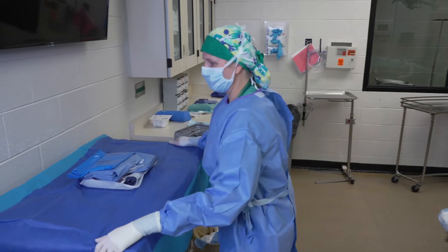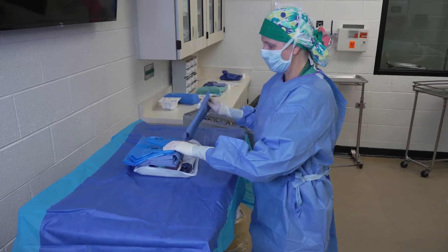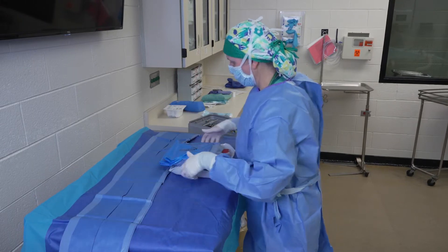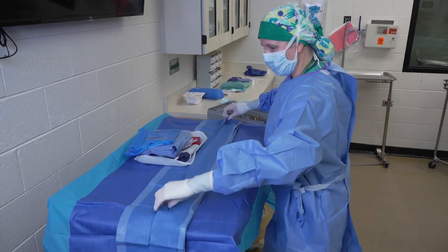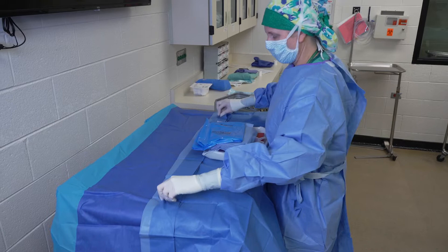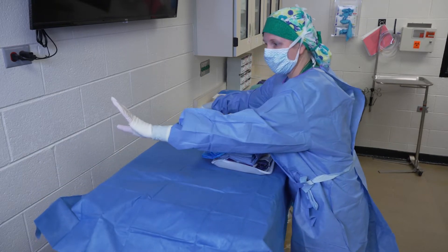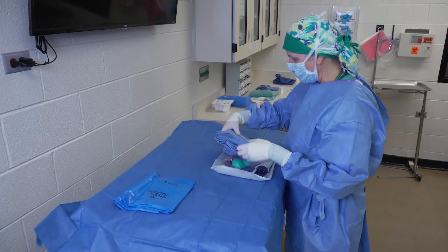We're going to get our back table set up before we drape our patient. In this pack we have not only a table drape but a patient drape. I'm going to start by opening the table drape, being careful that I don't contaminate it. I'm going to open the side towards me first, slide my instruments, then open the side away from me. I can wrap my hand under the drape so that if I were too close to the wall I don't contaminate my hand.